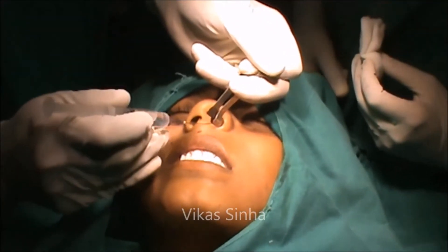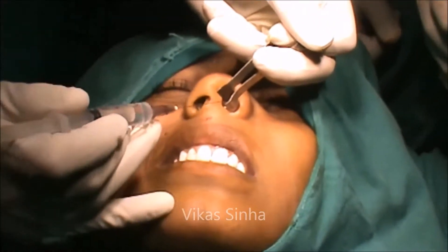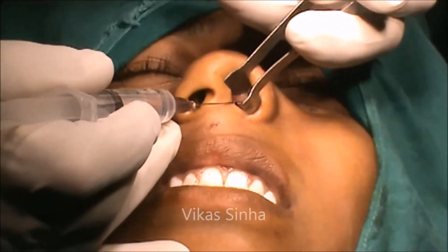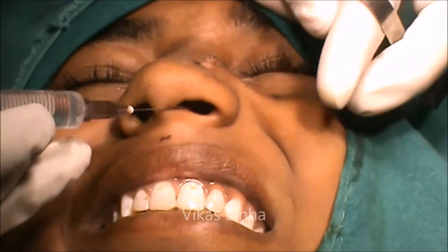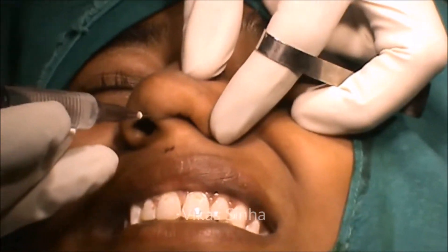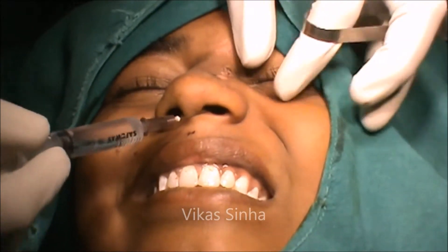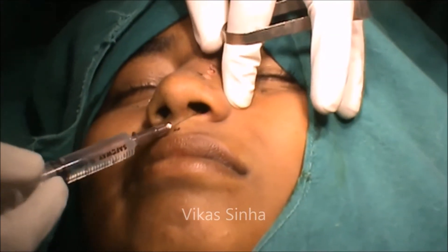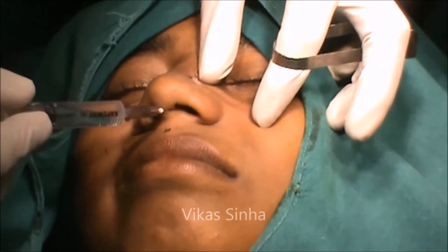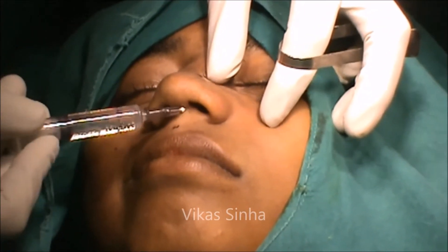Now I am introducing the needle for the 2% xylocaine infiltration. Through the inter-cartilaginous area, my needle is passing under the malar skin right up to the infraorbital region. My other finger is guiding the needle.